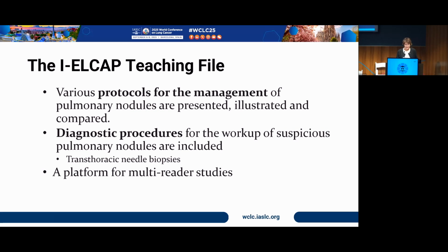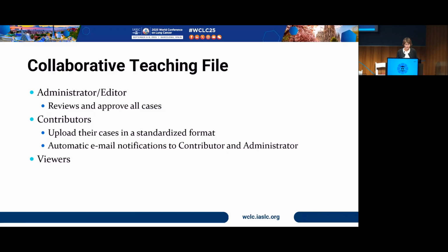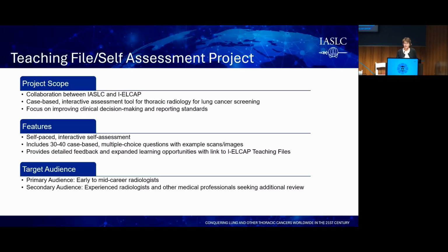And recently, it has also been a platform for multi-reader studies, and you will hear the first study that was performed using this platform after my presentation today. And we have various levels of permission, so anyone can view. People who receive special permission can contribute cases, and I currently serve as the administrator.